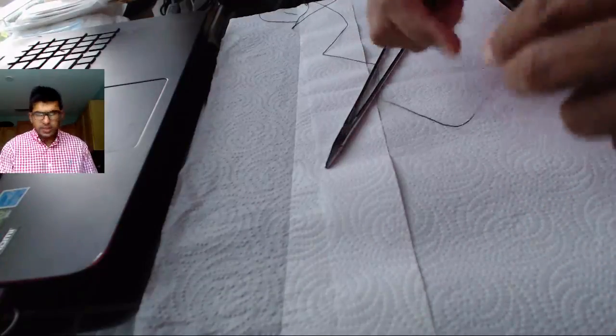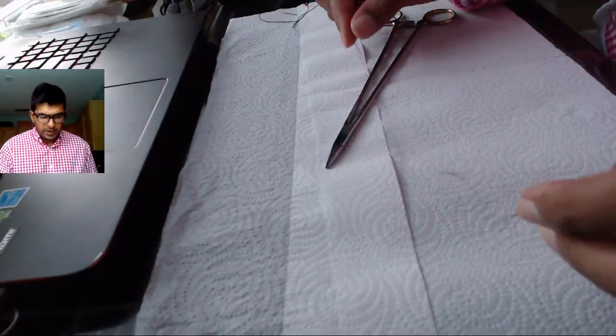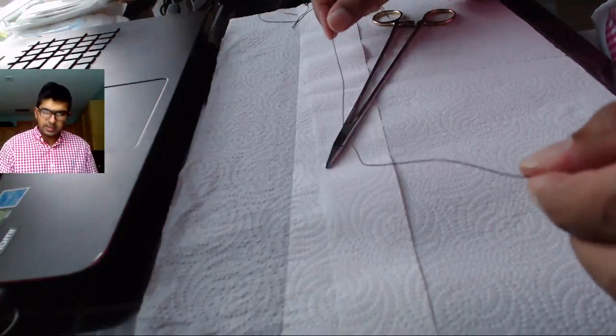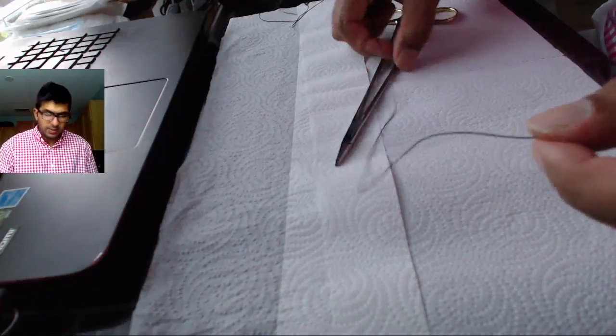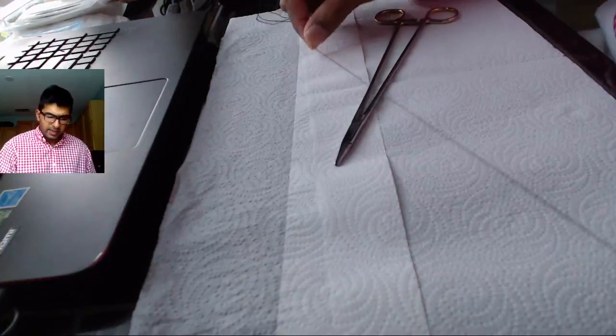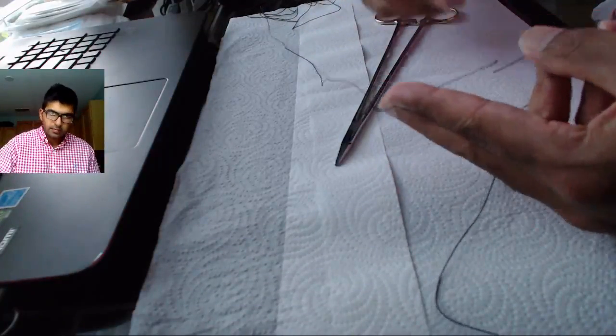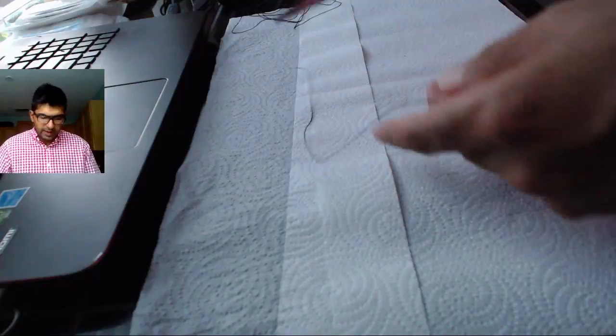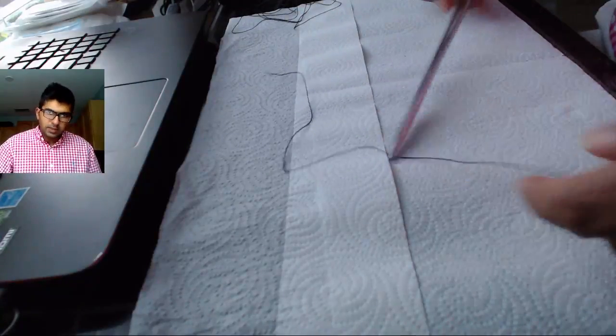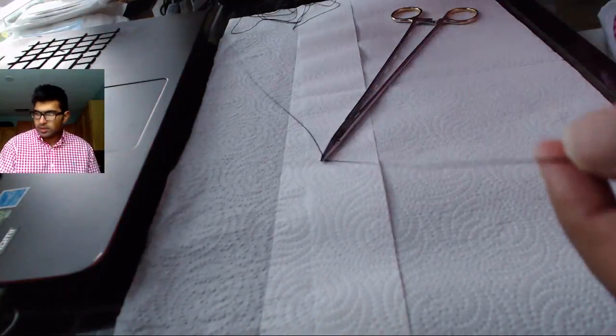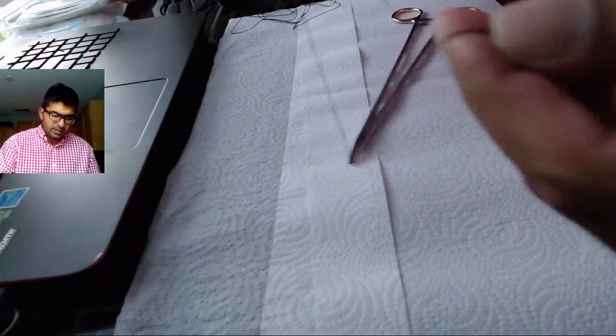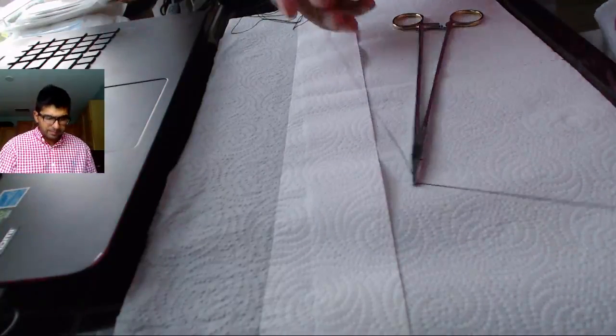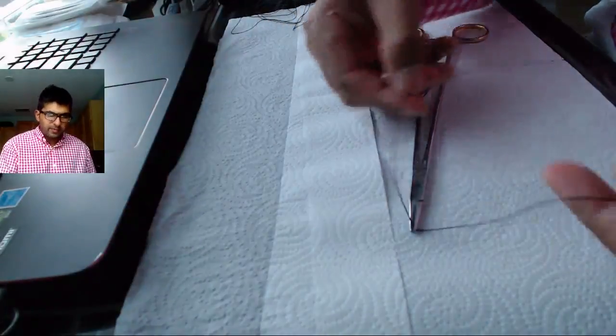So the first thing I want you to do is if you have these materials at hand, great. If not, you can always pause this or ask your friendly scrub tech to give you some of these materials, or just use something else. You can use a hammer, you can use whatever you want. So cut out a fairly long segment of this 2-0 silk. And the first thing is for the people that don't really know how to tie knots, we'll start real basic. So I'm going to clip this down to the table, which adds a fair amount of weight. And that's okay, you actually want a little bit of tension on this. And you can dangle and still tie the knots you want to tie.